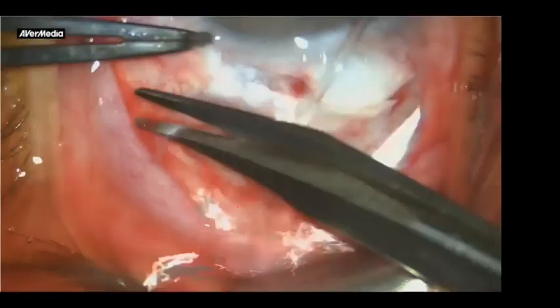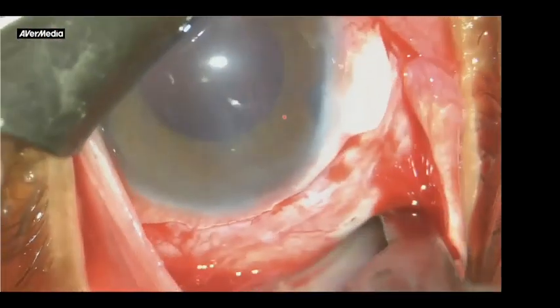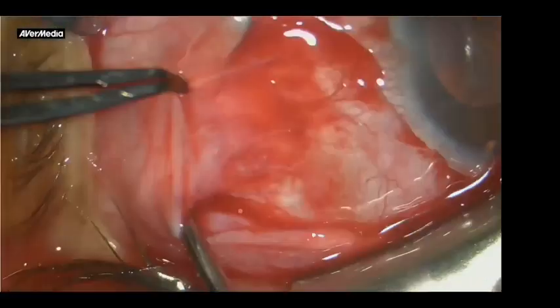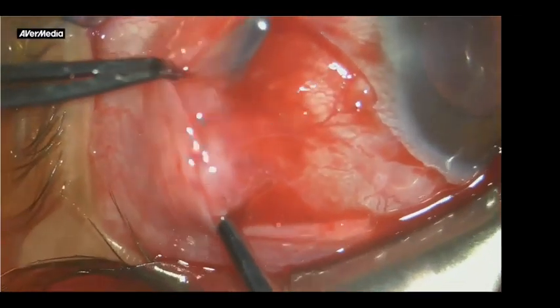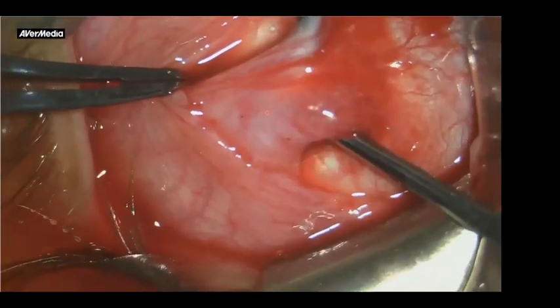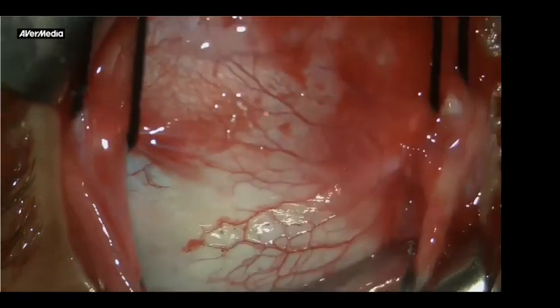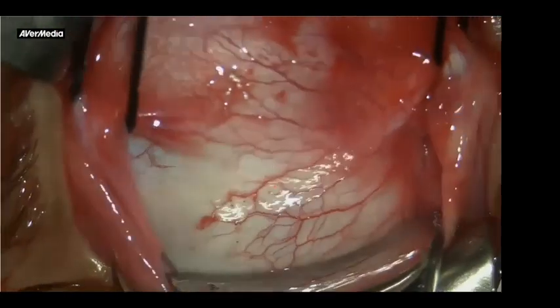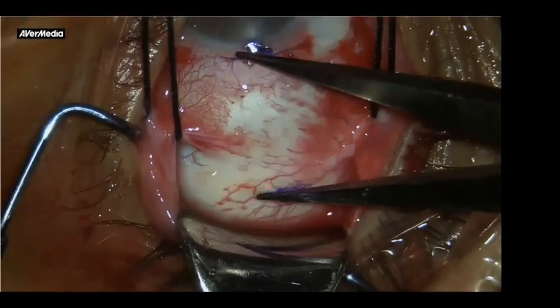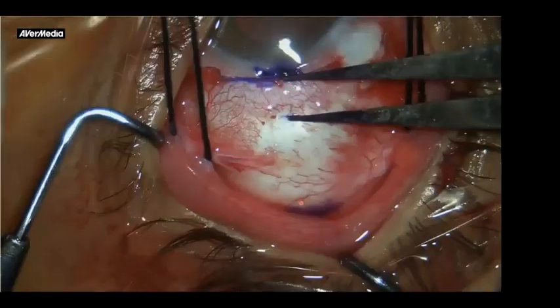So dissecting the conjunctiva, it was a recurrent pediatric glaucoma or juvenile glaucoma. So you can see a lot of Tenon's. And again, the artery forceps will help the separation. In this case, I just wanted to have good exposure by hooking the muscle, but I do this very, very infrequently. I use the corneal traction suture. Now I like to see the sclera, and then I do diathermy as needed. I retract the tissues, and then I measure 12 millimeters. Now, once the exposure is like that, I really feel happy, and I feel comfortable with the tunnels and the suturing.